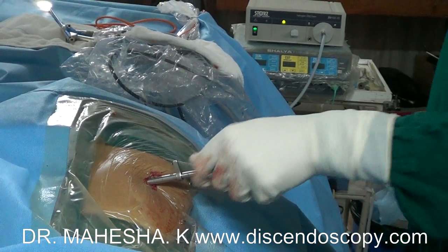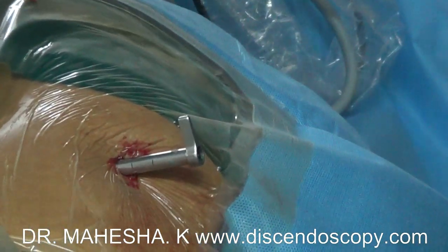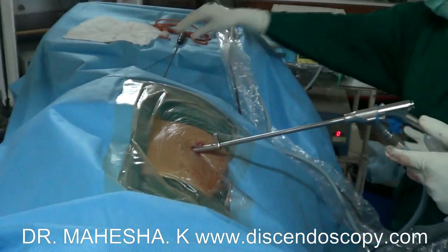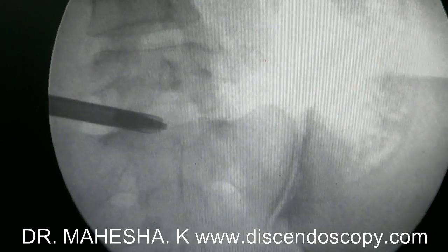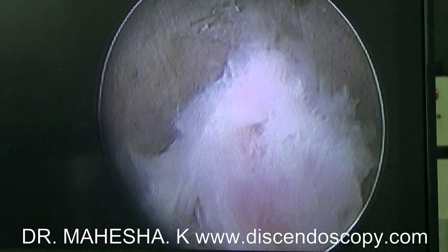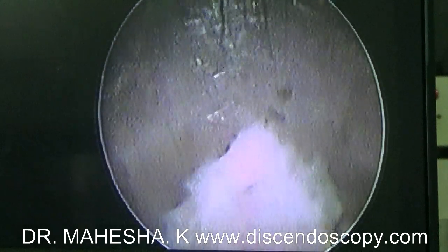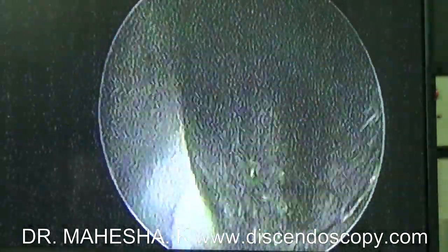Once the cannula is in the center of the disc space, the dilator is removed and the endoscope is inserted. Further surgery is done using the endoscope under vision. We can now see endoscopic pictures. We can see the herniated disc fragment at the mouth of the cannula. Endoscopic disc forceps is used to catch this fragment and remove it.